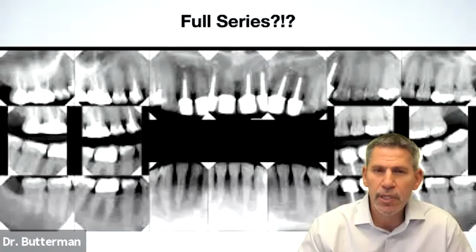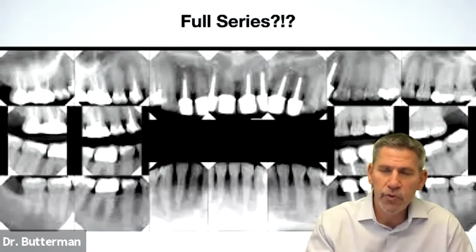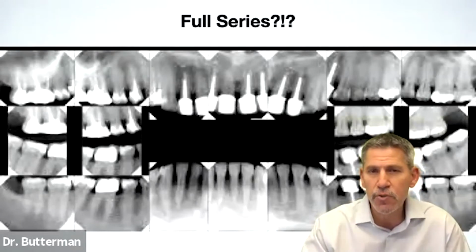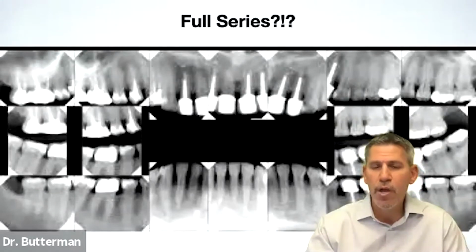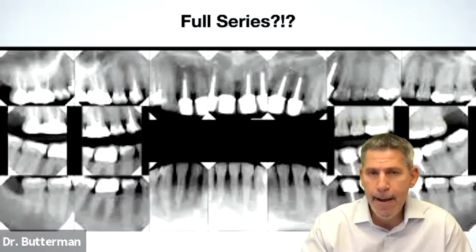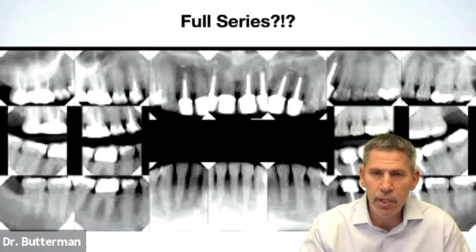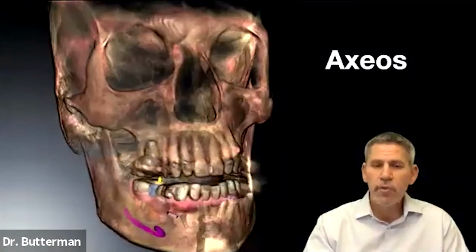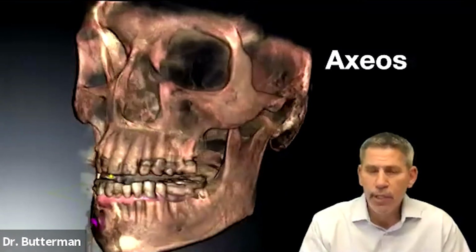When a patient comes in and they maybe transfer from another office and they bring me something like this, I quite honestly struggle with it because I'm just not used to looking at 2D images anymore, because we just don't have anywhere near the level of information that we can possibly attain. And arguably, we're exposing our patients to much more radiation on these full series of x-rays with 18 and sometimes 20 individual films. So when a patient comes into my office, this is what they are greeted to.